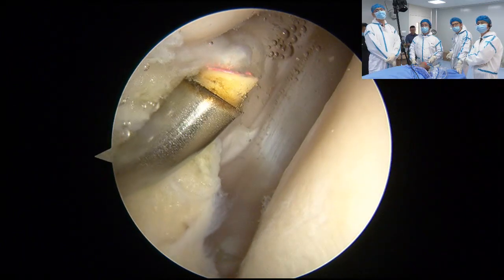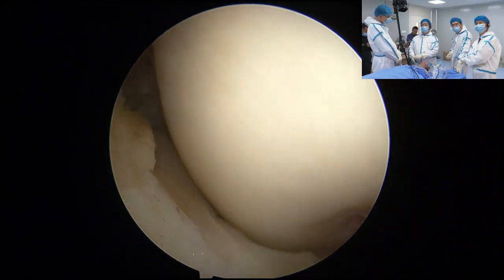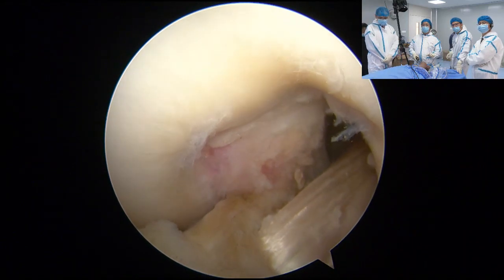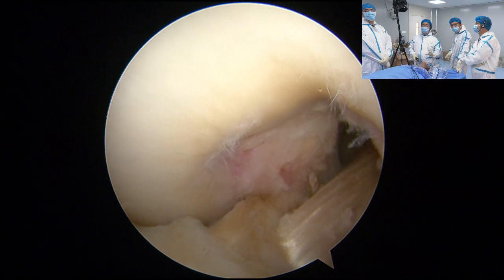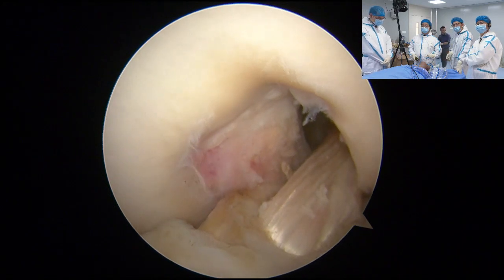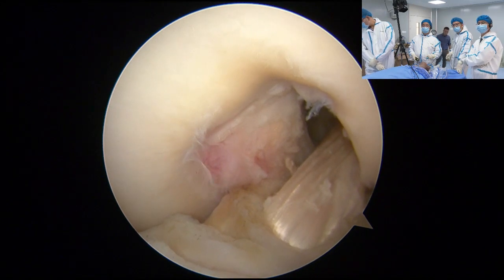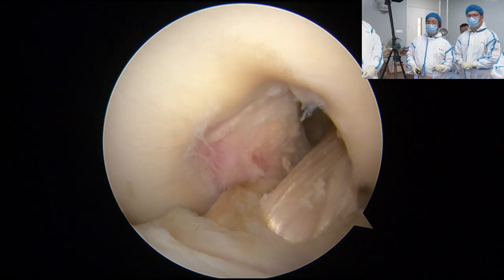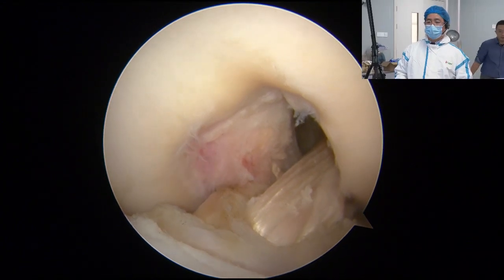Yeah. But you know, that's the small graft in the larger tunnel. Is it appropriate? No problem, because I think if you have a big size graft, the tunnel is always big enough. So our biggest graft is for a tunnel of 12 millimeters in a big size American. So no problem, you can fill the footprint using a 12 millimeter graft in the tunnel. Do you think what I do is good? That I can insert the graft into the femoral tunnel, and then transfer the other end into the tibial tunnel, and then I can make the best of the different sizes of the tunnel. That's nice.